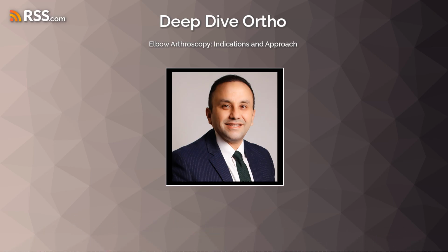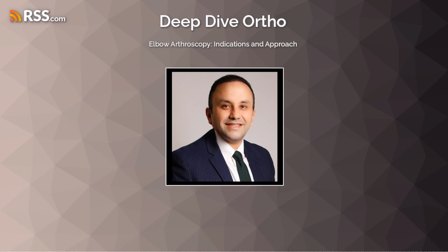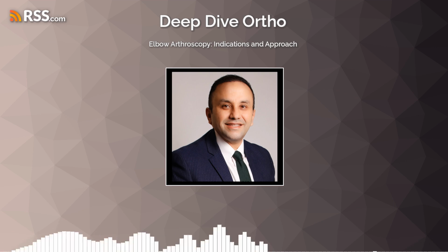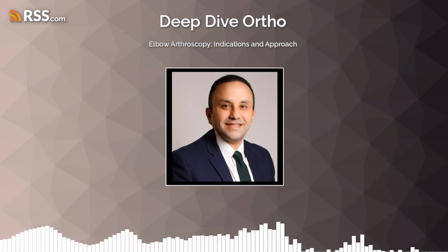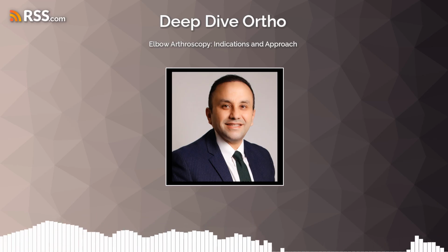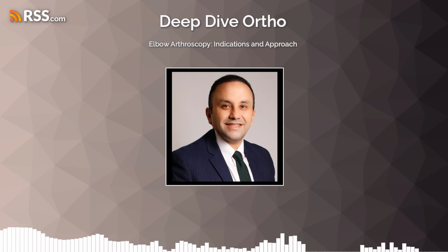You're absolutely right. The application of arthroscopy in fracture care is expanding significantly, offering a way to achieve precise reduction and stable fixation with considerably less soft tissue disruption compared to traditional open approaches. This is a real game changer for many patients. Let's consider the general considerations for elbow fractures.